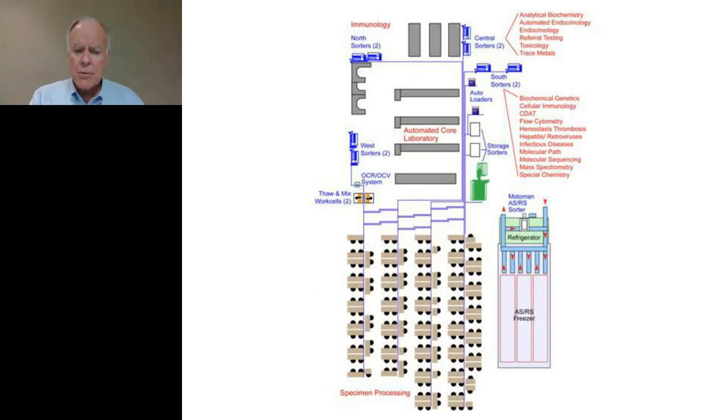And then here is the specimen processing department, and you see these what are called pods. Maybe hard to see unless you're looking at this full screen, but employees are seated together in clusters of 4. So the 4 employees all work on a shipment at the same time together. It makes those employees more efficient, and all of the specimens from the same client would be there together. So if one employee is working on the frozens and another one's working on the refrigerateds or whatever, it makes them more efficient and less likely to lose a specimen or misplace a specimen.